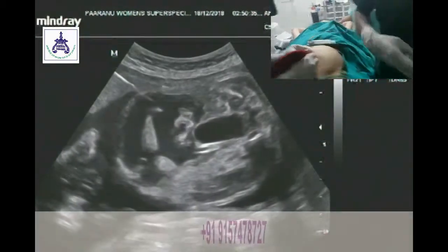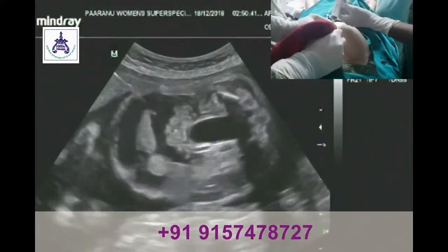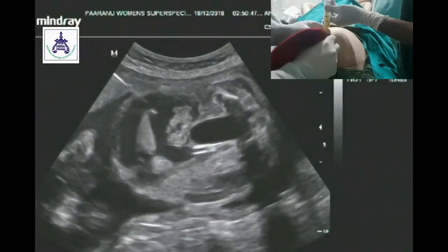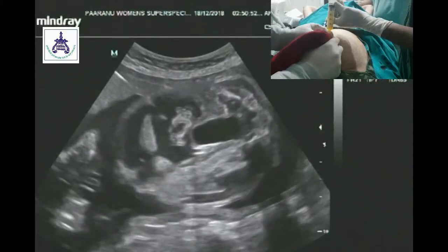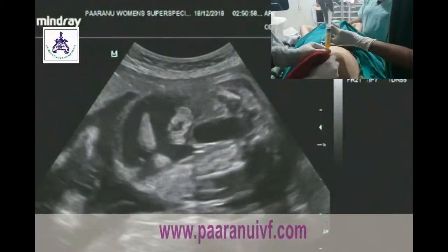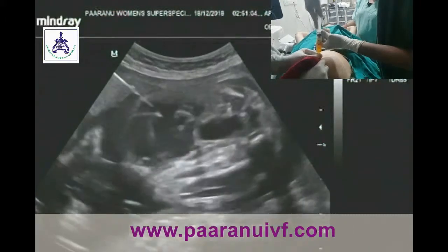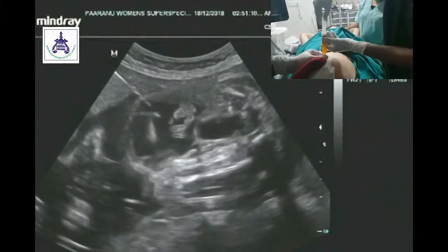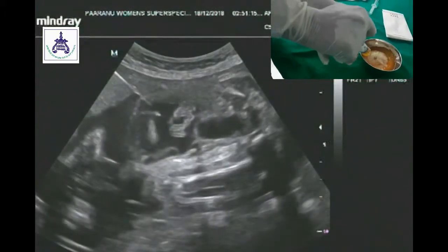Again you can see in the small screen. For the third time we are attaching the needle to the syringe, and we are aspirating around 20 ml of fluid. As we are aspirating the fluid, gradually there is decompression of the other abdominal structures, and gradual reduction of the fetal ascites. During this process, our needle is constantly under our vision in the ultrasound guidance. This is the third time our assistant is keeping the fluid in the bowl. So around 60 ml of fluid we have aspirated till now.